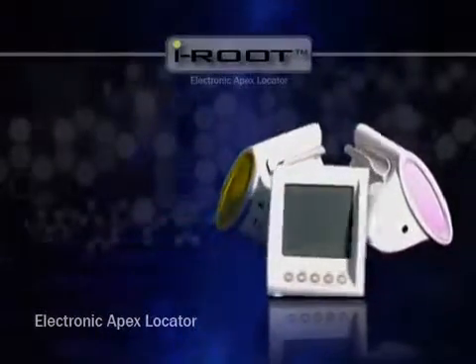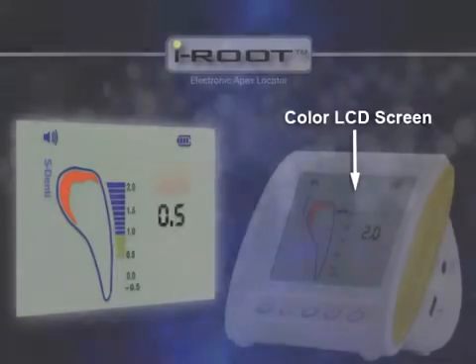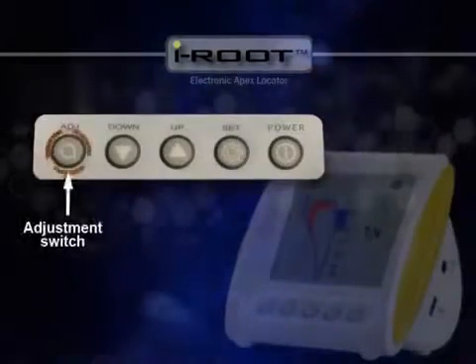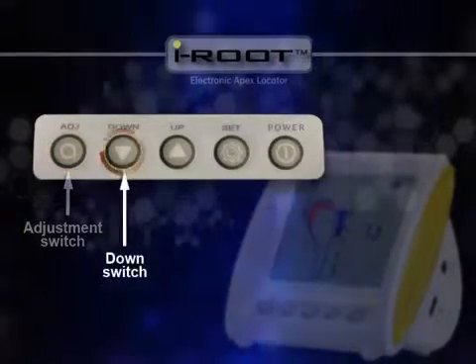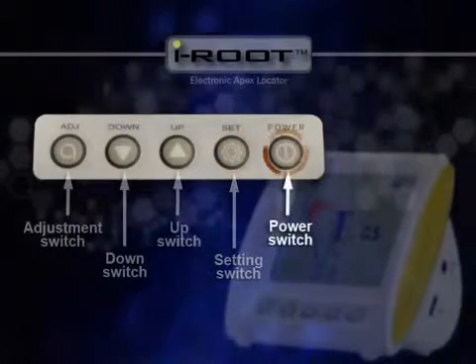First, let's check out iRoot's appearances and parts. On the front is the color LCD screen. The button panel has ADJ, down, up, set, and power buttons from left to right.